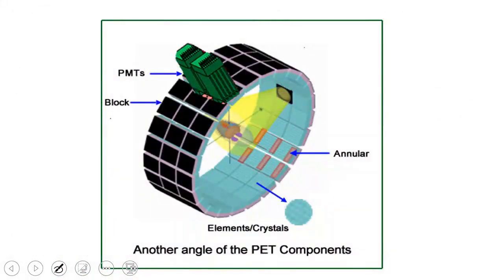Look, here is the range. This is 1 ring, this is 2 rings, this is 3 rings. So you are covering a large area in the body of the patient at once. Now, do you expect the coverage in the extremities to be the same as in the center of the ring? The resolution at the periphery will be different at the extremities.